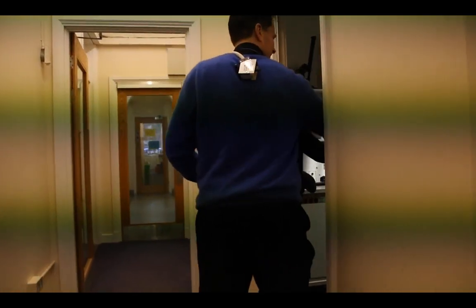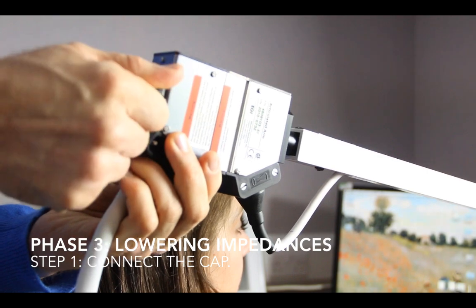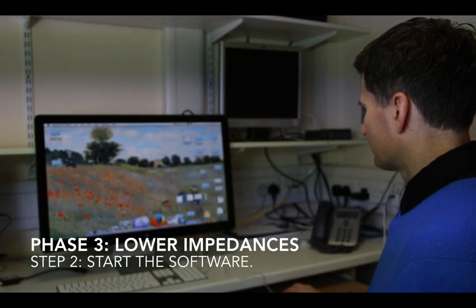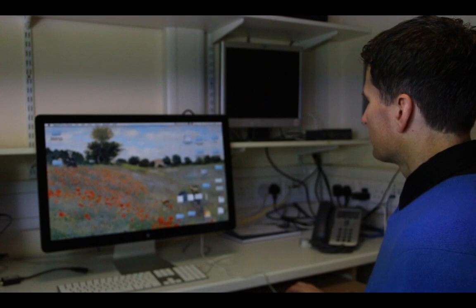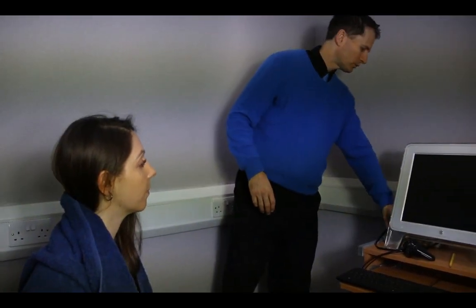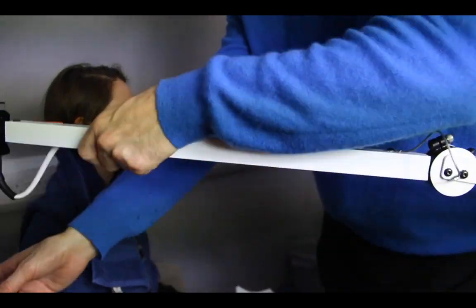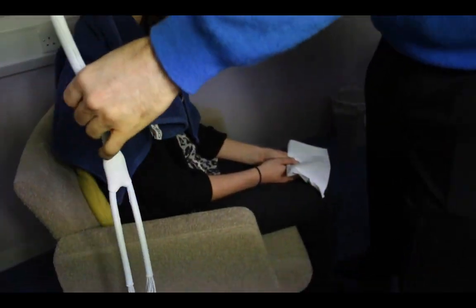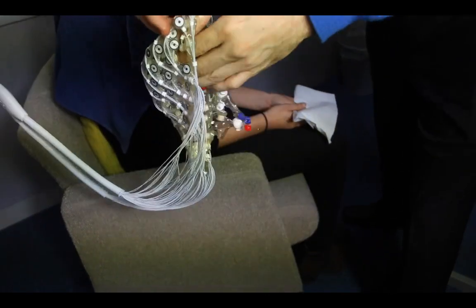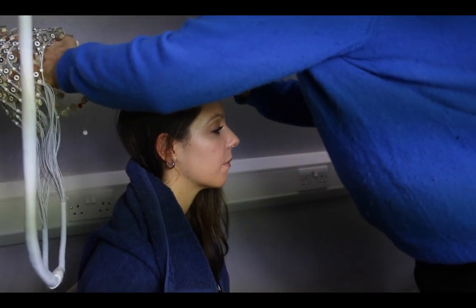The last phase of preparation involves getting the best possible recording from each electrode by lowering the impedances. Start by connecting the cap to the electrical recording equipment, then launch the recording software. Make sure your participant is comfortable and has everything they need, such as tissues or a towel around their shoulders. Then place the EEG cap on the participant's head by spreading your fingers on either side. There is an electrode in the middle of the cap called CZ — place this directly on the X mark you made previously. This is a very important step.